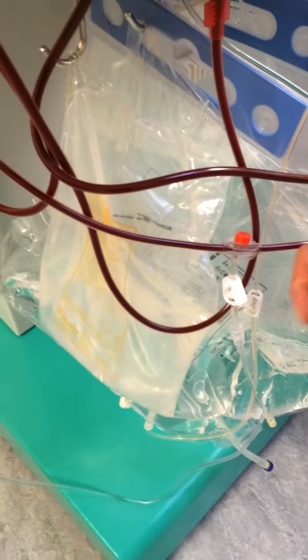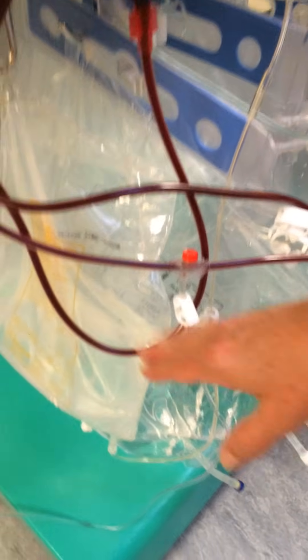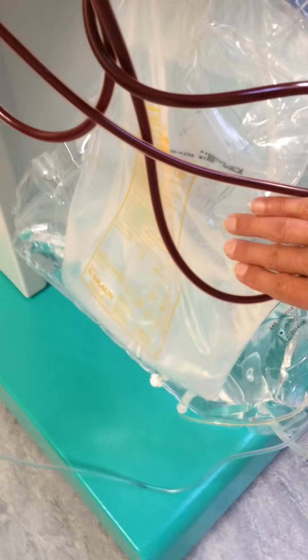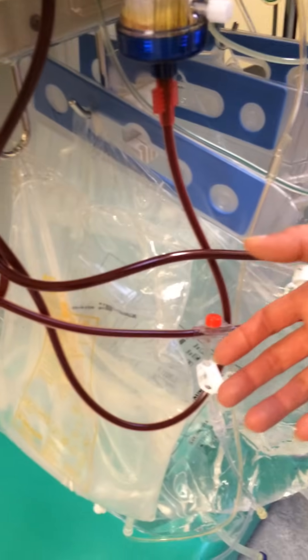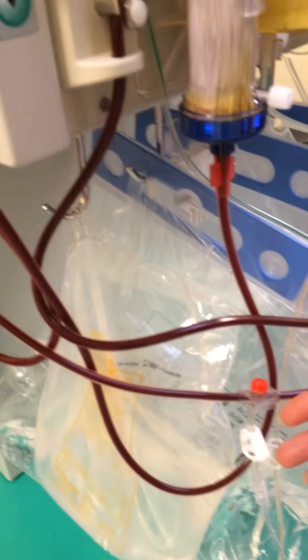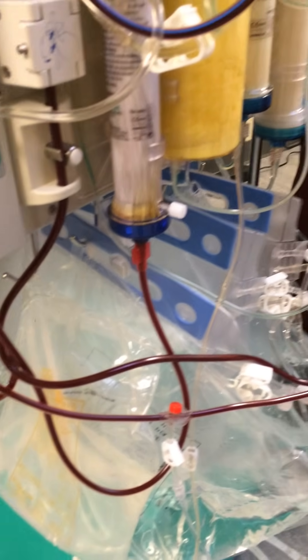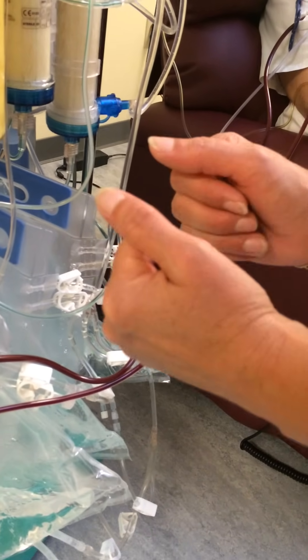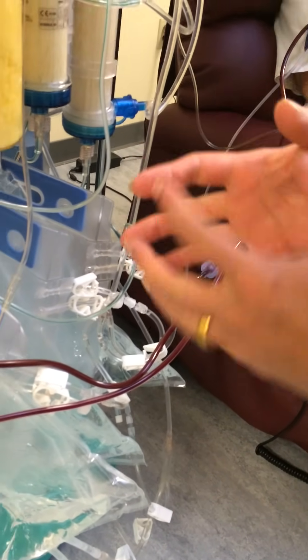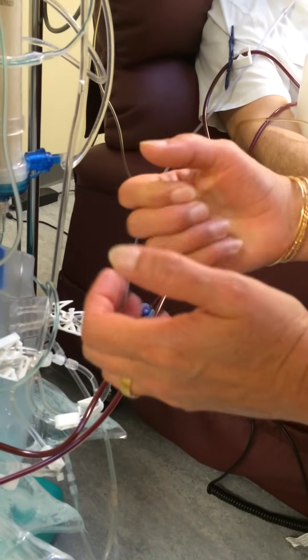That fluid is an acetate buffer solution — a special solution to which we add a large amount of heparin: 300,000 units. The pH of this solution is 4.85, and when we add the extra heparin, it changes the pH to 5.12. At 5.12, those molecules become more positively charged and bind naturally to the negatively charged heparin, which causes a precipitate — and that's exactly what we want: the binding of the elements we're trying to remove from the plasma.